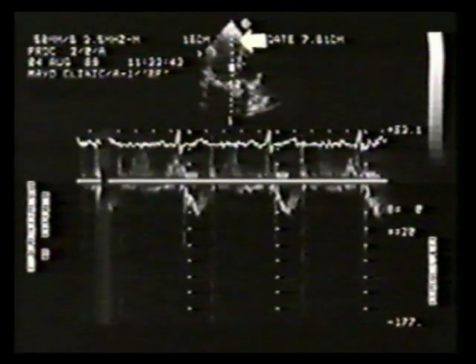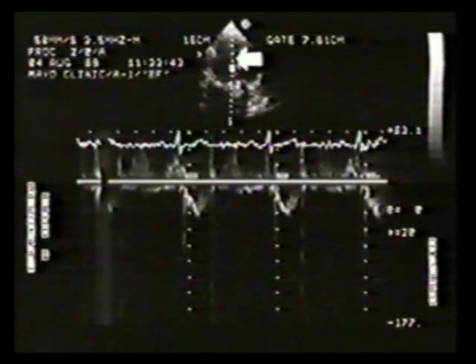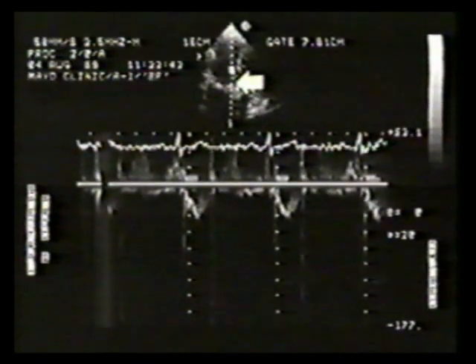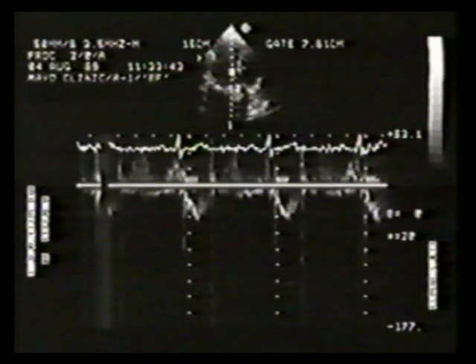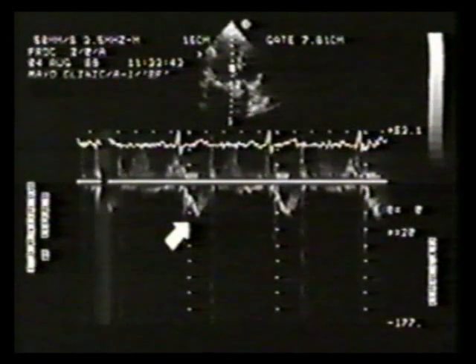The small image shows the Doppler cursor crossing the LVOT. The sample volume is just about to enter the LV outflow tract. In real time, you will notice an increase in the velocity as the sample volume is advanced into the outflow tract.